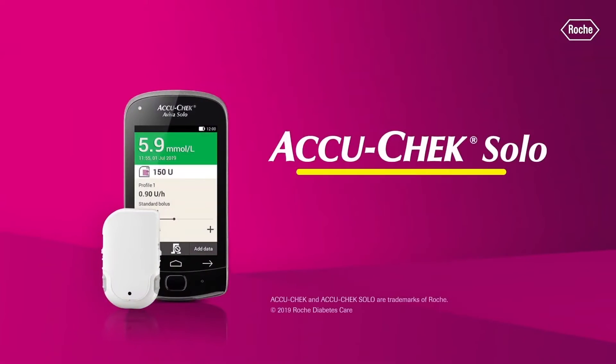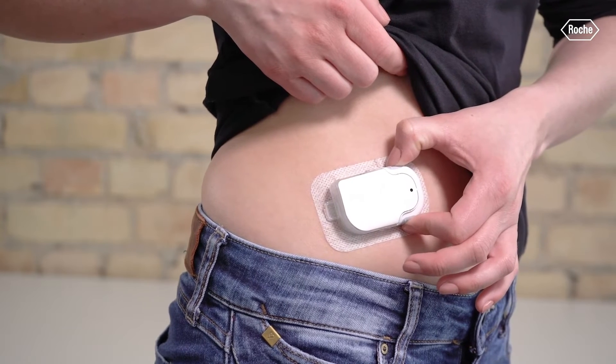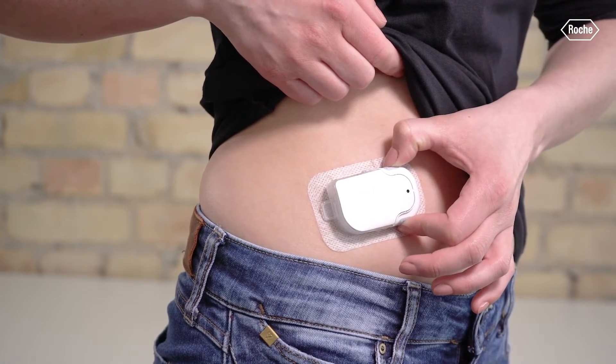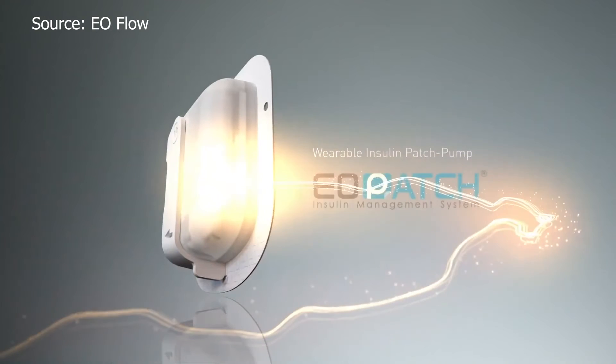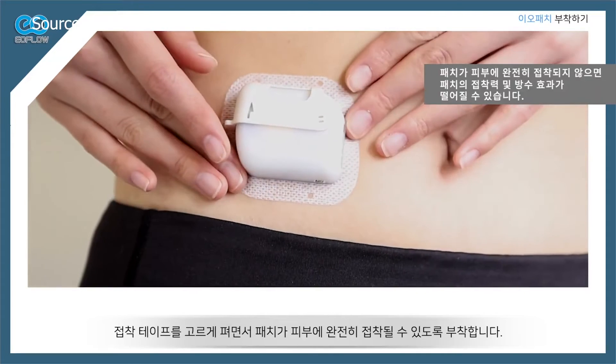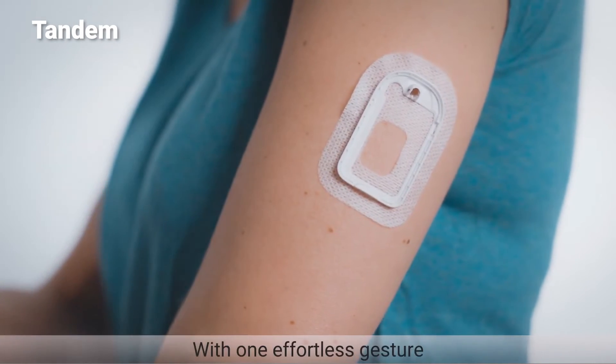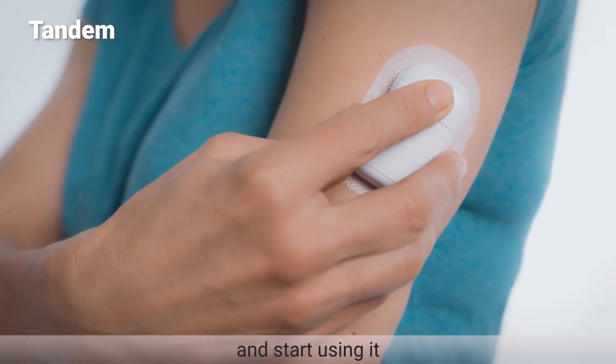Ultimately, what this pump symbolizes is more competition in the space. Omnipod now has a bit more pressure because of this pump and its quick bolus buttons, which are pretty awesome when you aren't near the PDM. Then there's Medtronic's Eoflow and the Cigi pump acquired by Tandem. Tubeless insulin pump innovation is going to be driven way faster because all of these pumps are entering the market.